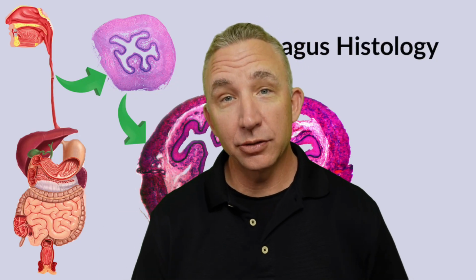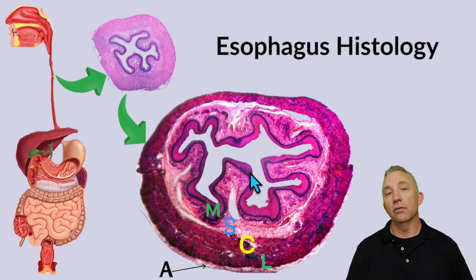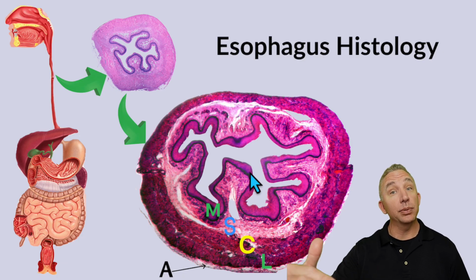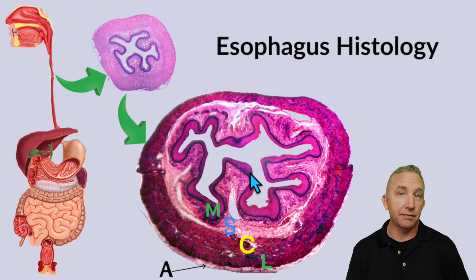What's unique to the esophagus is looking at the inner layer, which we call stratified squamous epithelium. So that stratified squamous epithelium is unique to the esophagus. When we go through stomach, small intestine, large intestine, then the rectum, it's lined with simple columnar epithelium. The structure creates the function. It's stratified in the esophagus, meaning 2+ layers, so multiple layers of cells, and we typically use that for protection.